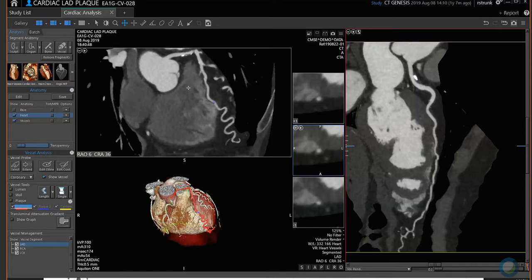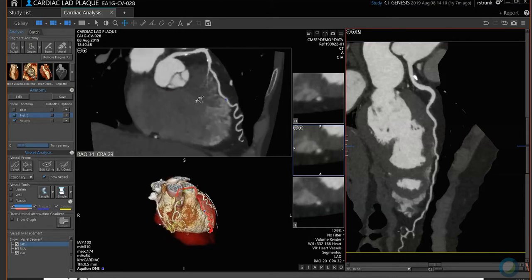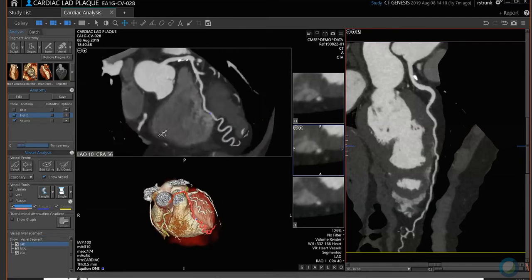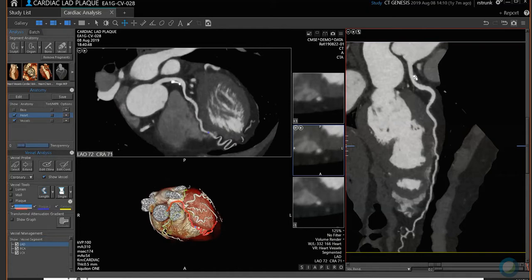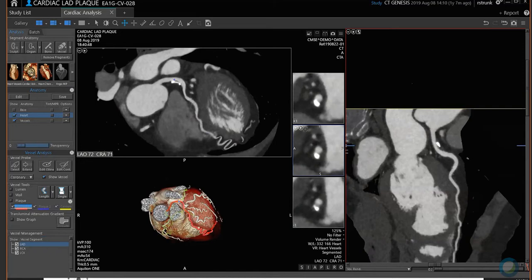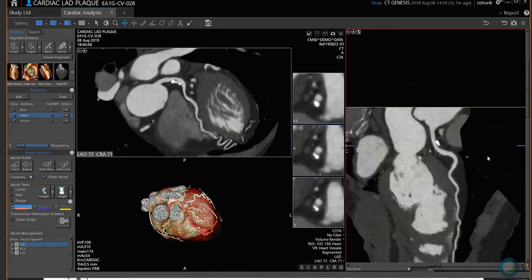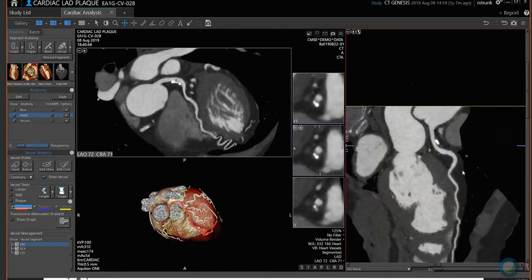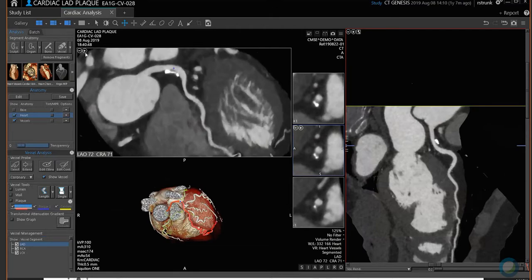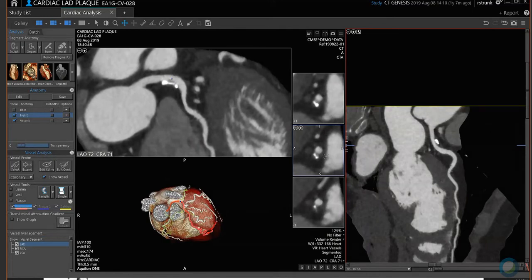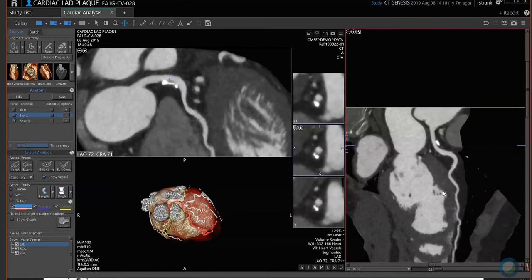What's nice about that — and it's all LAD because that's what we've chosen — is if you hold your left mouse down, you can rotate this to get a better view. If you see an area with calcium and want to look at it, just click on that area. It brings up an image that is always perpendicular to the center of the vessel, so now you can see a transverse image. The blue dot shows where you are, and as you scroll up and down, you can see it moving. This is a cross section of that vessel, with one millimeter above and one millimeter below.